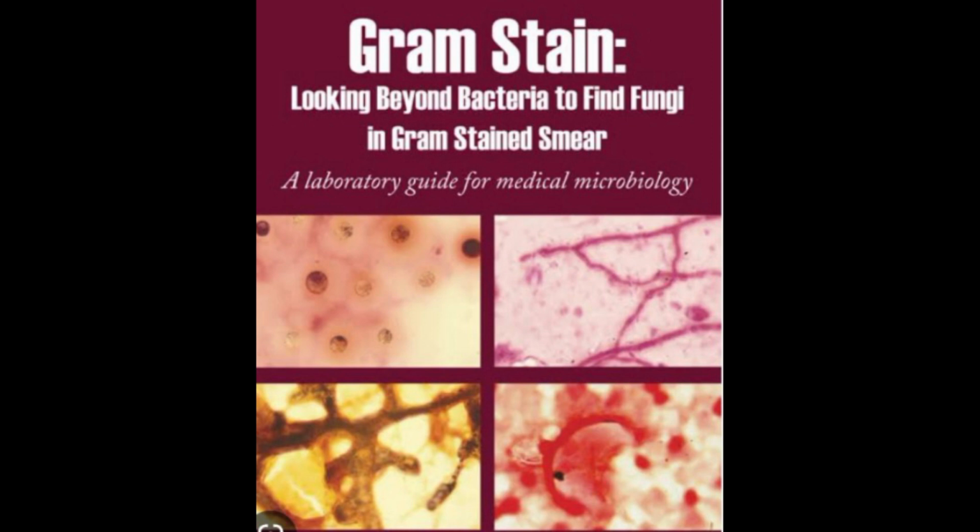Aspirate from different sites and catheter: collect the specimen aseptically in a sterile screw capped container. Swabs from different sites: collect the eye swab specimen, swabbing the lower inferior conjunctival fornix, avoiding the eyelid border and lashes, with a sterile cotton swab. Collect the ear swab specimen, swabbing the external ear gently, avoiding the pinna, with a sterile cotton swab.